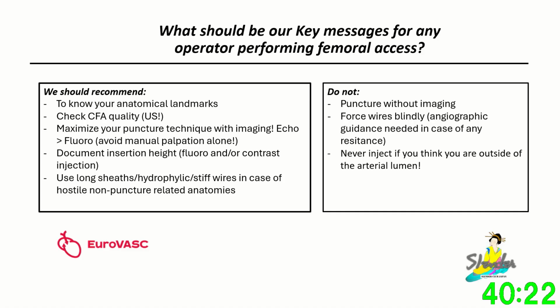You should use long sheaths or hydrophilic or stiff wires in case of hostile non-puncture-related anatomies. I think we should also recommend: do not puncture without imaging, and do not force the wires blindly. Angiographic guidance is needed in case of any kind of resistance, and never inject if you think you're outside of the arterial lumen. It can be extremely dangerous during the femoral puncture.